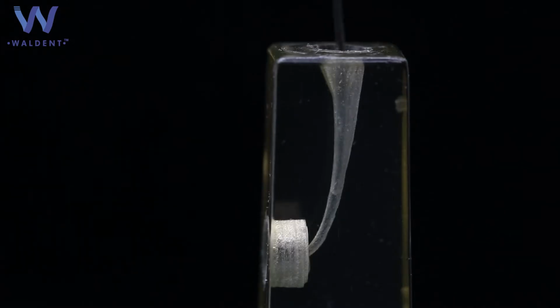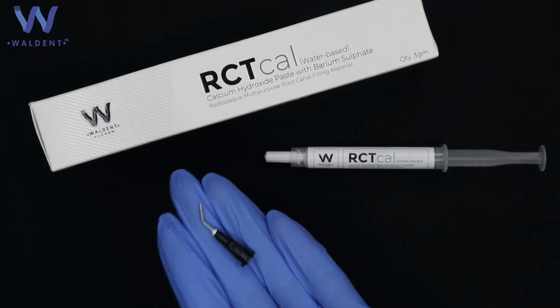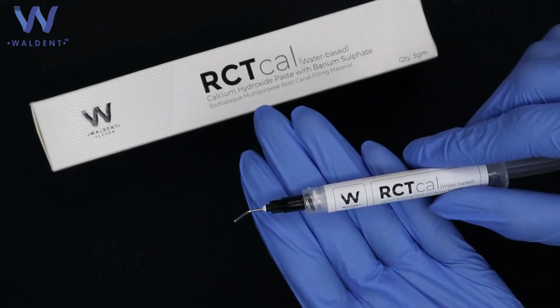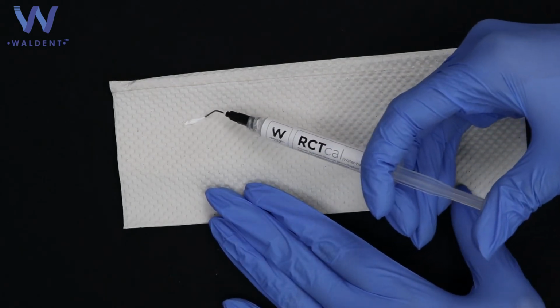After the biomechanical preparation of the canal, disinfect and dry the canal completely. Then insert the dispensing tip into the RCTcal tube. After attaching the tip, check for a smooth flow of material before using it in the patient.